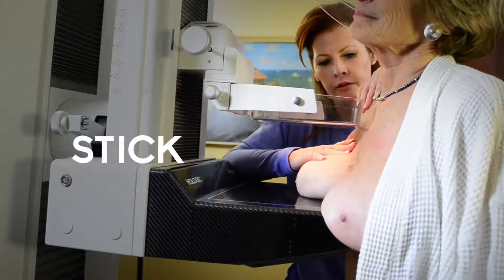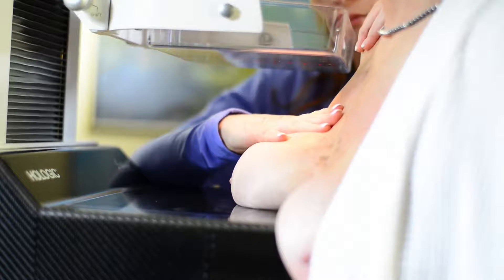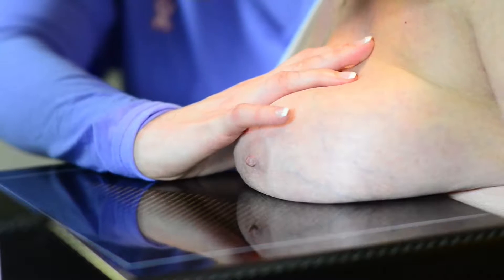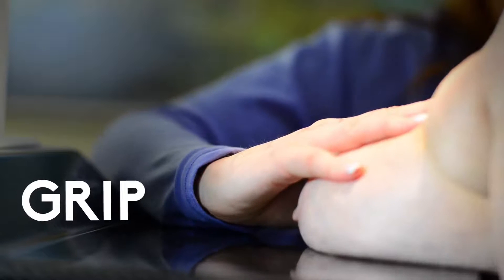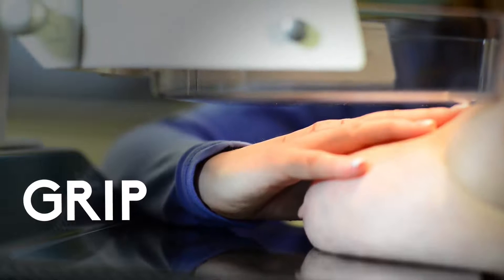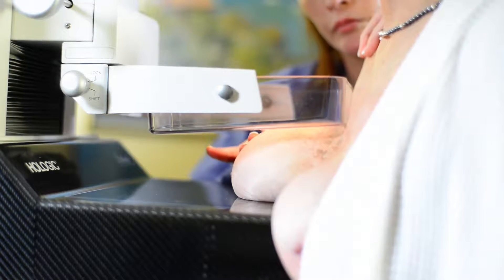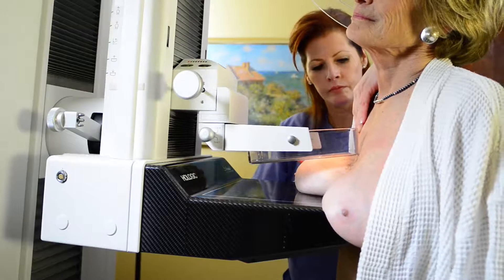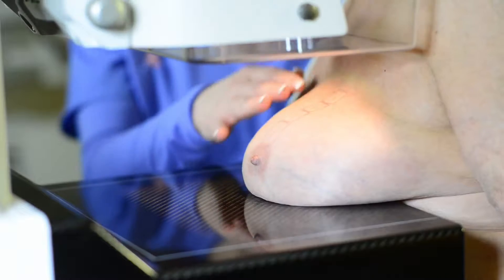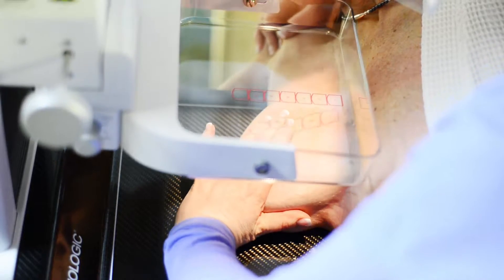Next is Stick. Anchor the breast from the top and pull downward. Remember to position the patient's hips out away from the machine — this brings her chest as close as possible to the detector. And Grip — this is where Mammogrip makes a difference. As you pull the breast downward onto the detector, Mammogrip helps you hold it in place with less retraction as you apply the compression. That's because Mammogrip is slightly tacky. You should see how much tissue is acquired superiorly and beyond the cleavage before taking the exposure.